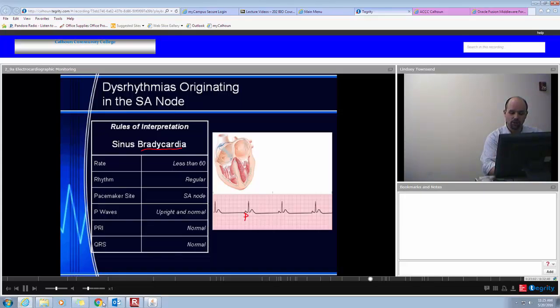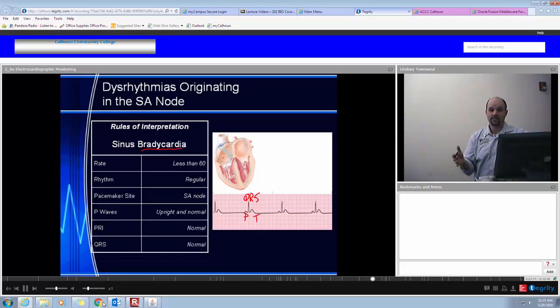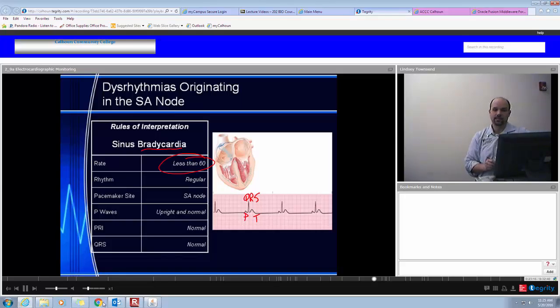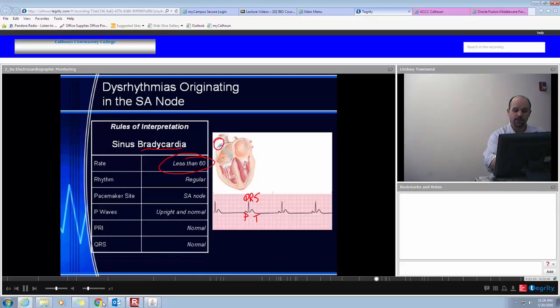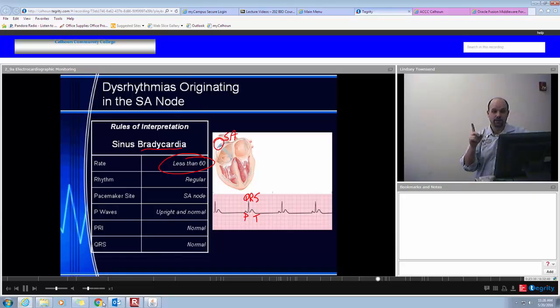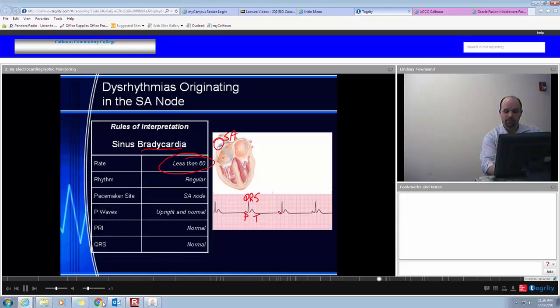Just a bit on timing. We talked about small boxes meaning 0.04 seconds and large boxes meaning 0.2 seconds. In this normal tracing, we have the PQRST complex — and this complex spans about two large boxes. Each large box is 0.2 seconds, so we have 0.4 seconds for that one complex to contract, which is about normal.